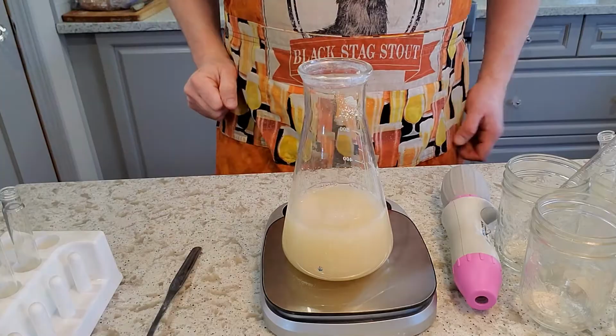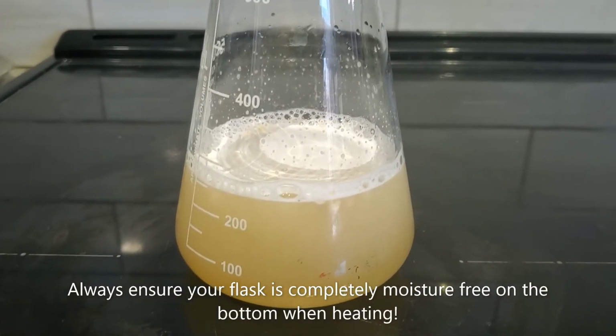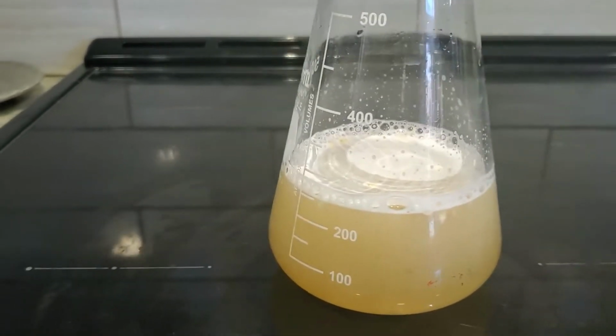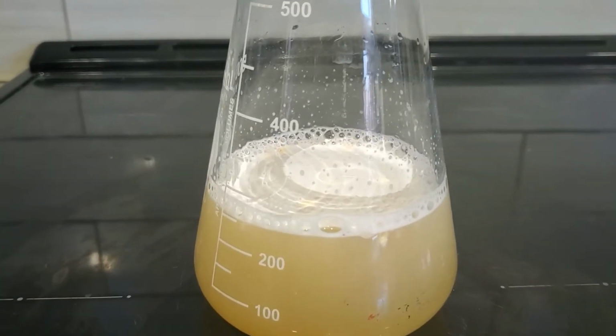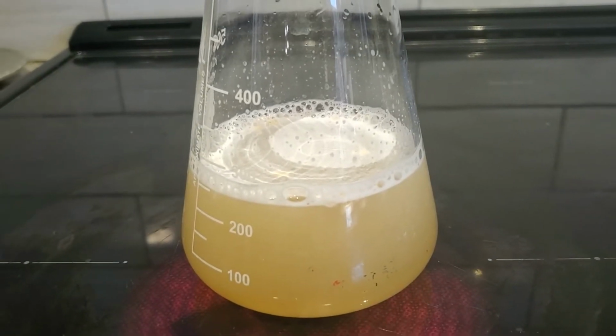Now it's time to heat this up. So I've just got this flask heating up on the stove top here, just on a low heat. I'm not in a massive rush for this. We're not taking this to a boil. We're simply getting it nice and hot so that everything is dissolved in solution and mixed up.